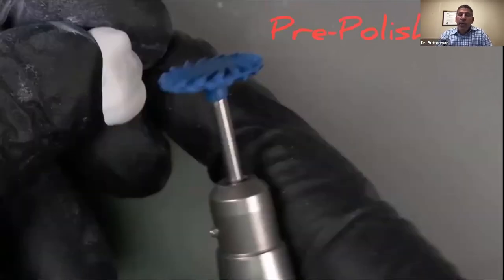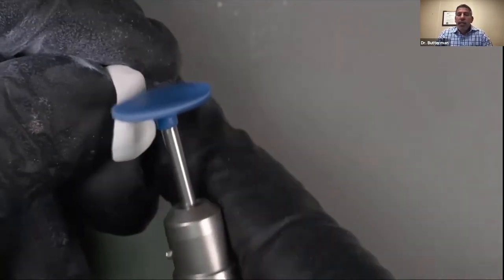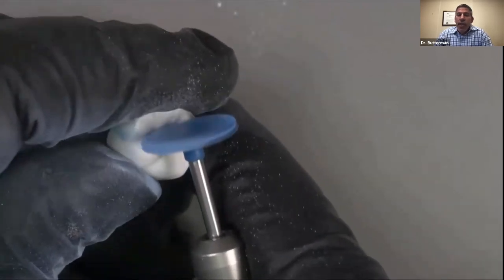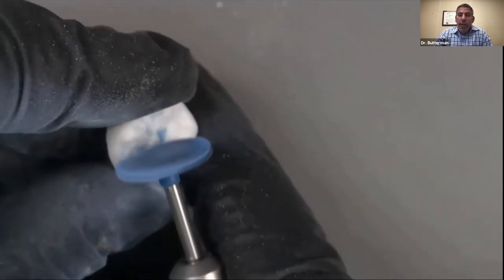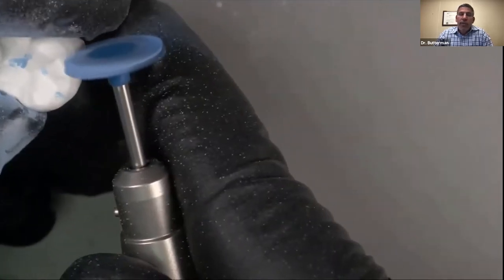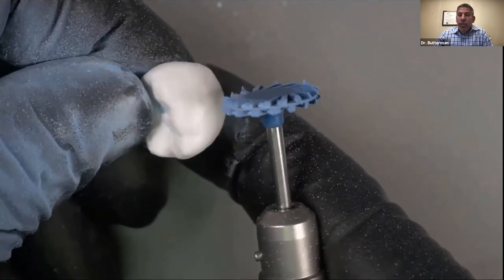My preference is now to come back with a blue spiral polisher. This is from Meisinger. And it's just going to take the burr marks off. This has nothing to do with aesthetics at this point. All I'm trying to do is remove the roughness and remove the scratches. I want to be careful not to be too heavy-handed with this. I'm running this at about 10,000 RPM. I don't want to touch the contacts. If I hit the contacts with this blue, this pre-polish, it's going to open up those contacts. So I'm just doing the occlusal surface, buccal, and lingual, and I'm just taking the scratches off. This is not polishing at this point. So we want to be a little bit careful and not put too much pressure.